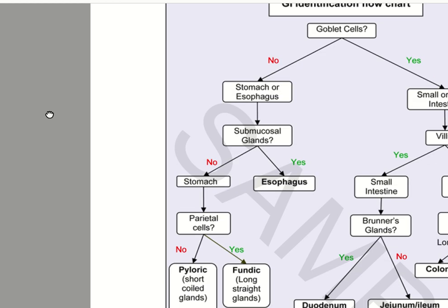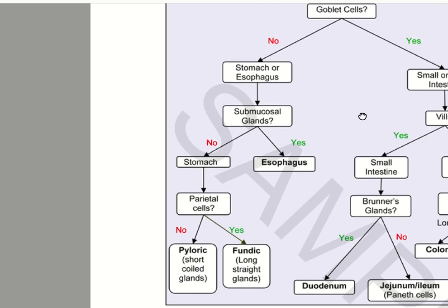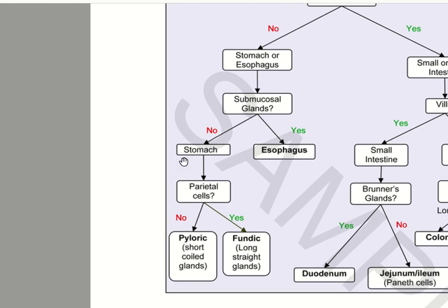And for some reason, my mouse is not really cooperating all that well with me, so I will just go ahead and take a snapshot of this and send it to you guys. But these are some of the things that you can walk through.